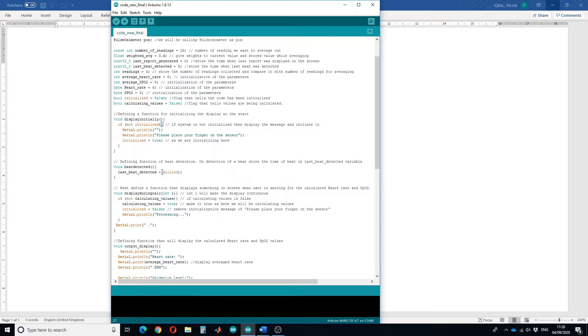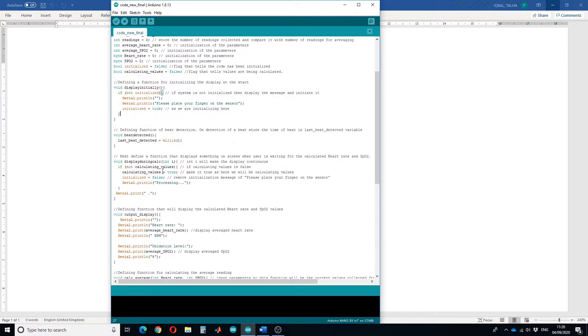The third function is for displaying something on the screen when the user is waiting for the calculated heart rate and SPO2. This function will print "processing" while we are calculating the values.